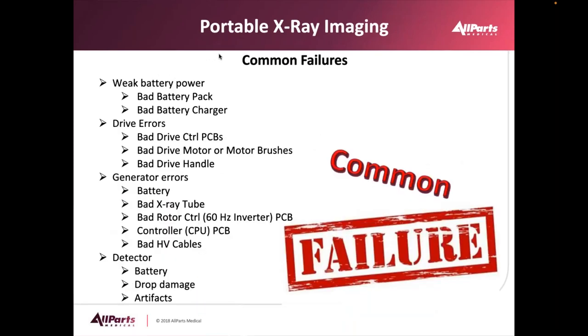Here are some of the common failures you might find in a portable x-ray unit. Bad batteries, they become resistive. Most battery packs only last about 4 years. Bad charging circuits. Drive motor errors. Bad drive control boards. Drive motor brushes. Bad handle controllers.